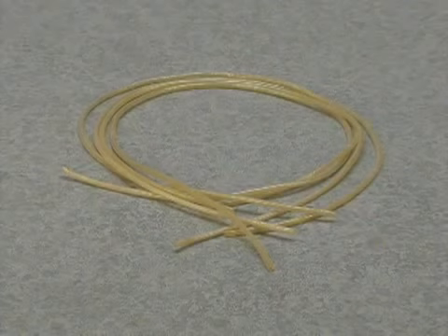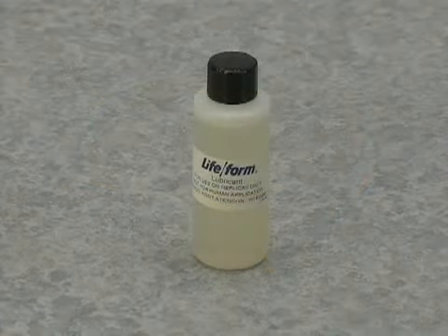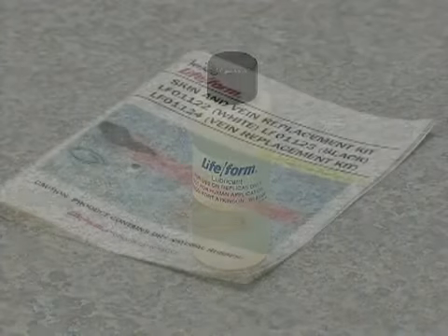Do not remove the outer film from the tubing, as this will negatively affect the quality of the arm. The kit also includes Nasco lubricant and a color-coded instruction manual.